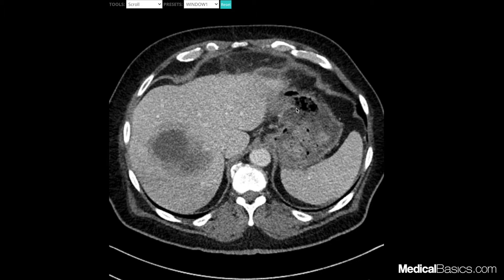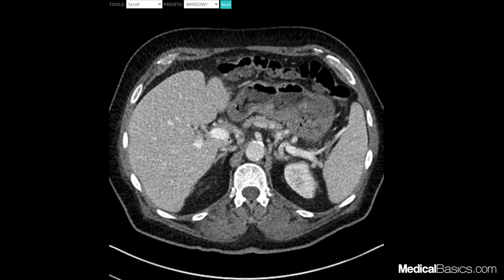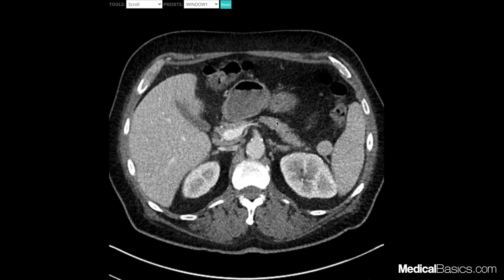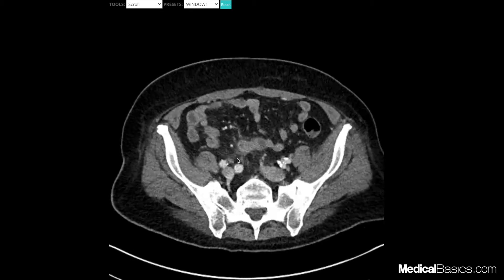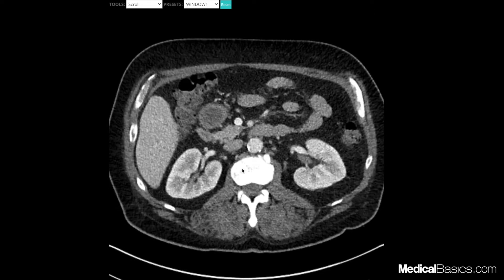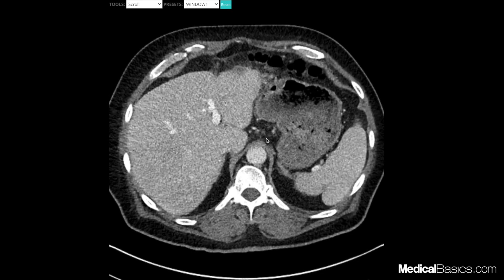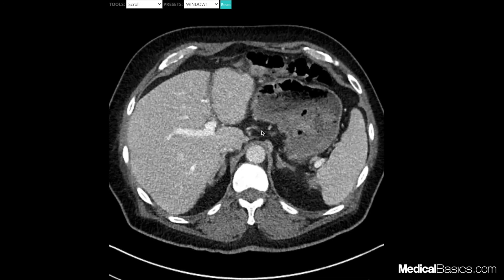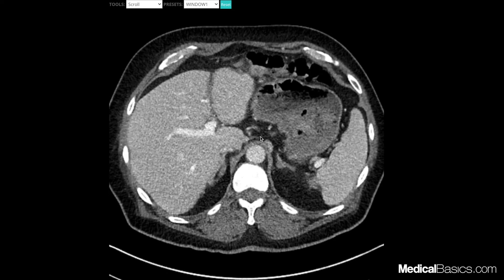What you're going to be looking for — this is our liver, this is our stomach, this is our spleen. This is our portal vein, so the porta hepatis. This is our IVC, this is our aorta. When we bifurcate, we go into the common iliacs, then our external iliac, and then our internal down here. First thing is the gastrohepatic lymph node station — we see maybe a few gastrohepatic lymph nodes, nothing abnormal. When looking for lymph nodes, they almost look like vessels, but when you scroll through them, they're going to disappear. Those are going to be our gastrohepatic lymph nodes.